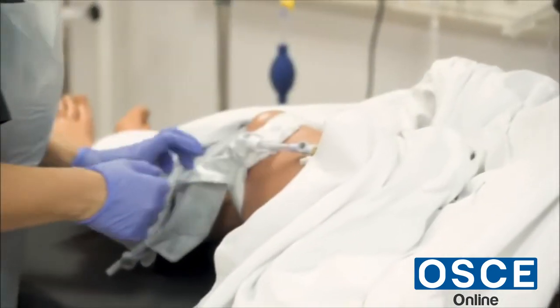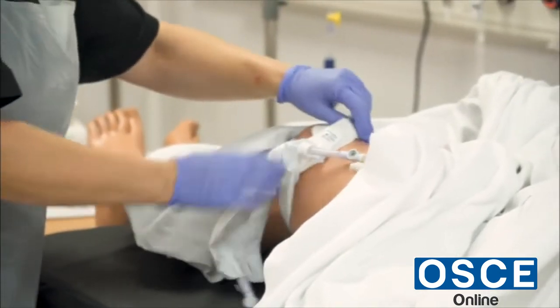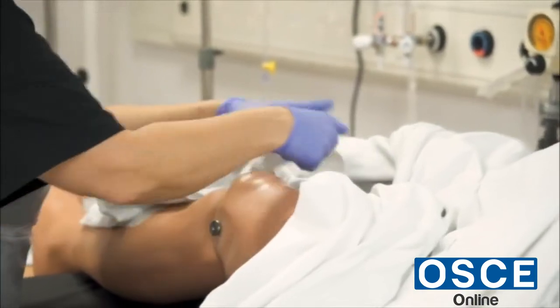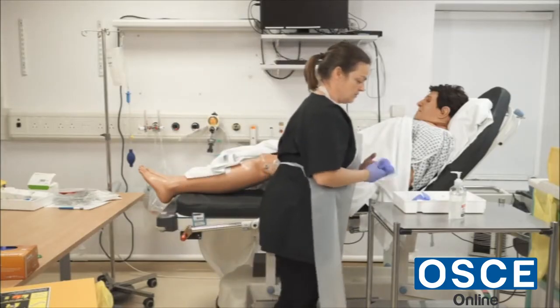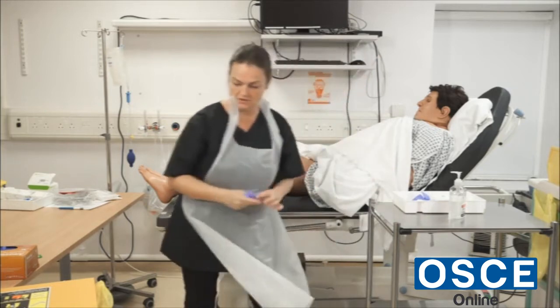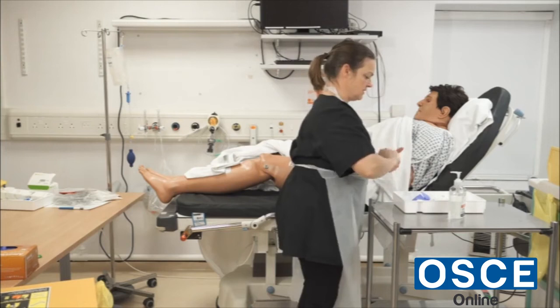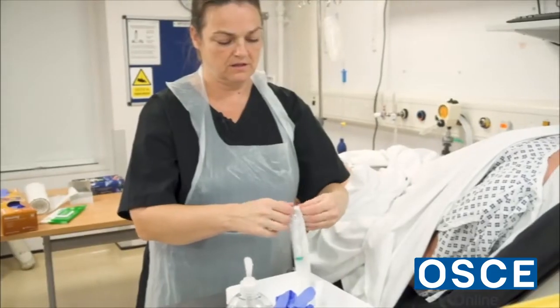I can see that the urine bag is empty. I will undo the leg strap and place it between the patient's legs. I've now touched the catheter, so I'll take some new gloves, gel my hands, and open the syringe ready.